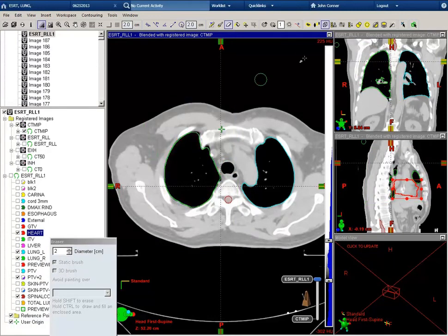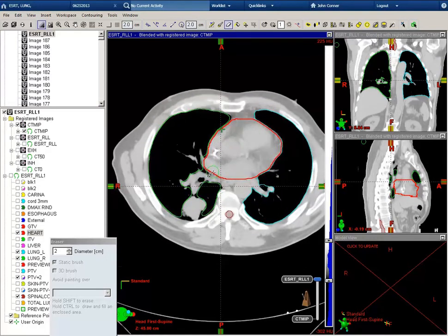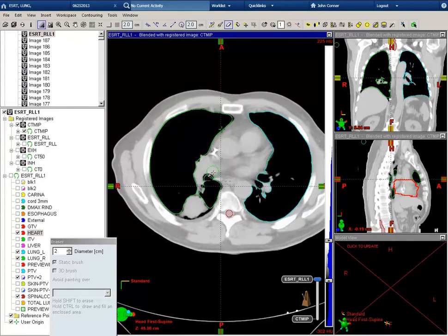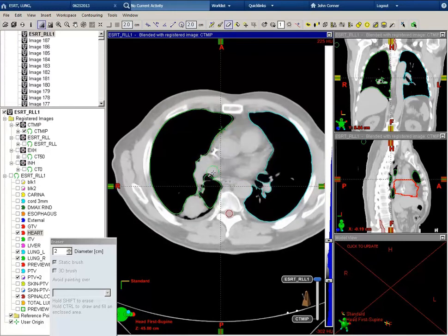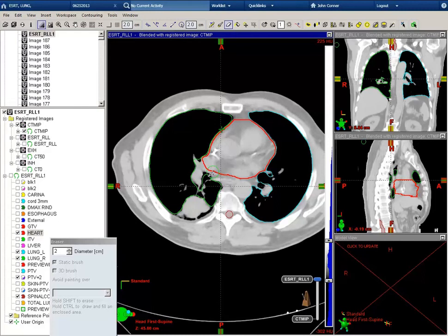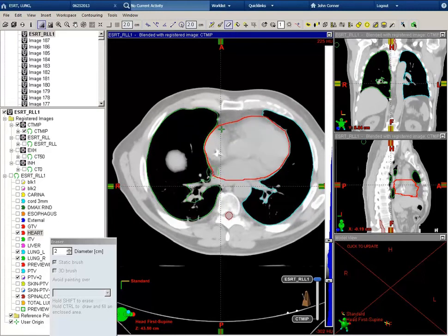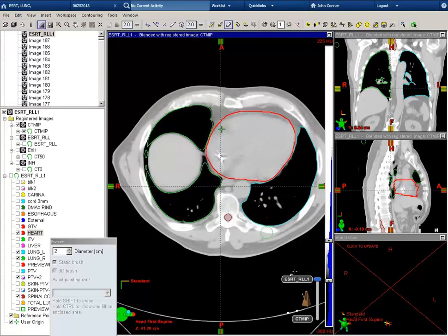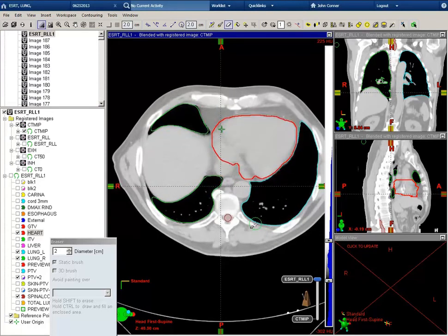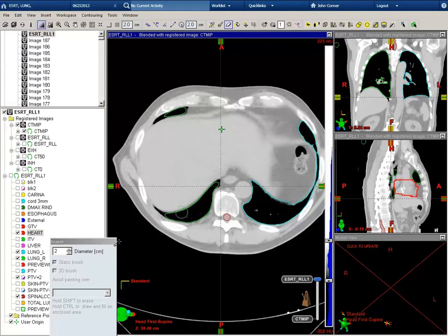Let's move on to the heart contour. The heart is here in red. The first slice of the heart is where the vessels start entering the chamber. So you can see here are the vessels — that's our most superior slice, and then it starts entering the chamber of the heart. We've used the red outline to contour the heart, and continue inferiorly until we don't see the heart contour anymore.